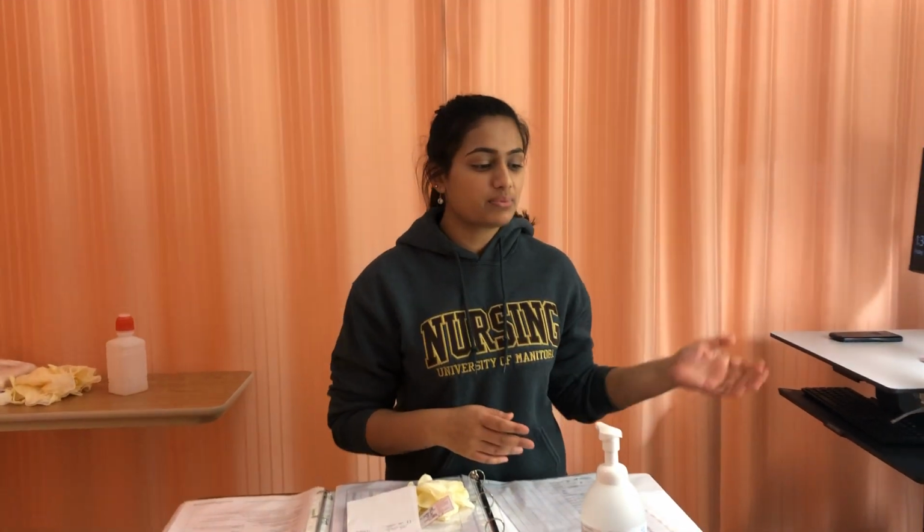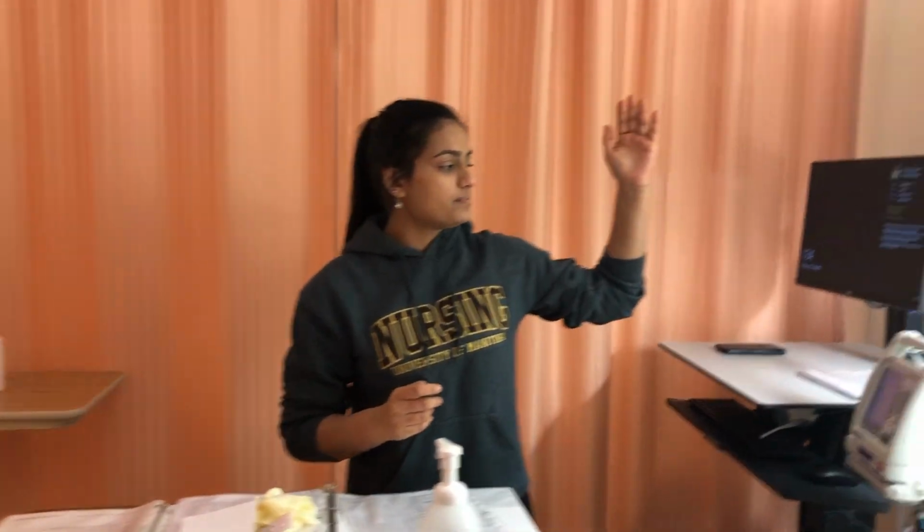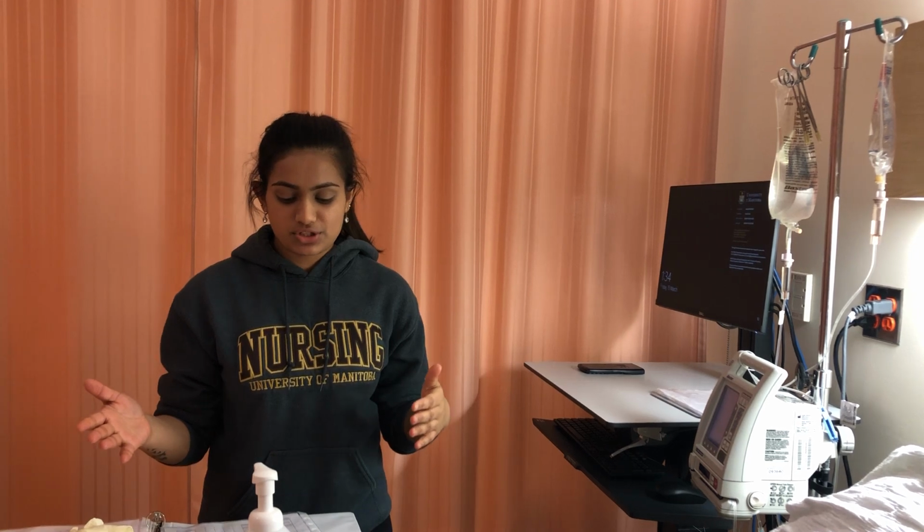Hi everyone, I'm Grace and I'm going to be demonstrating how to administer heparin via continuous infusion as well as performing chest tube care. So I'm going to perform hand hygiene. So first I have heparin here. It has been primed by the previous nurse. However, I'm going to be administering it.